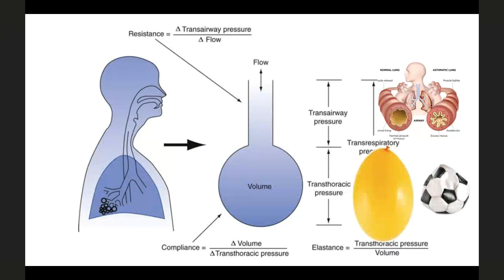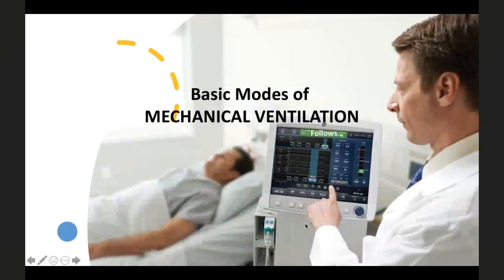So these two will pose two different sets of characteristics in our monitored parameters. Depending on that, we'll troubleshoot the ventilator. So remember, throughout the course, you are not treating the ventilator, you are going to treat the patient.